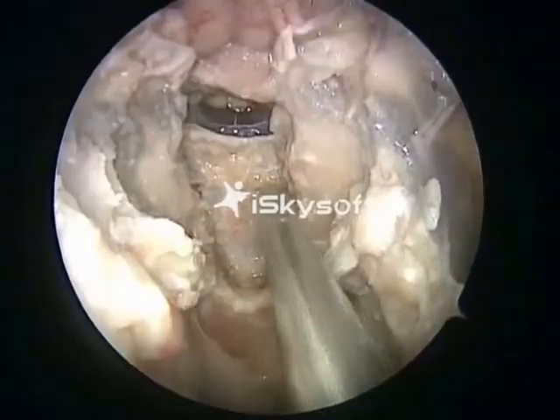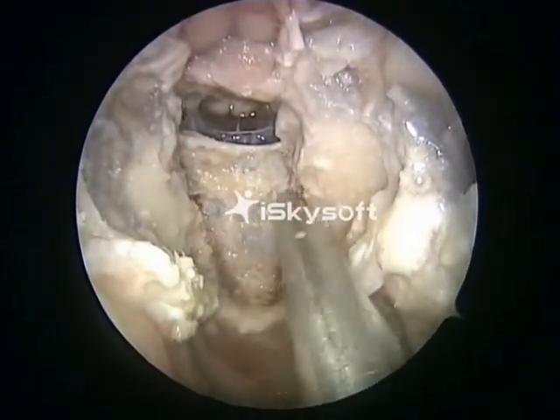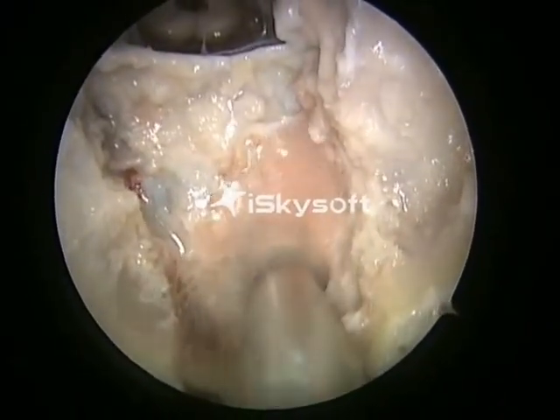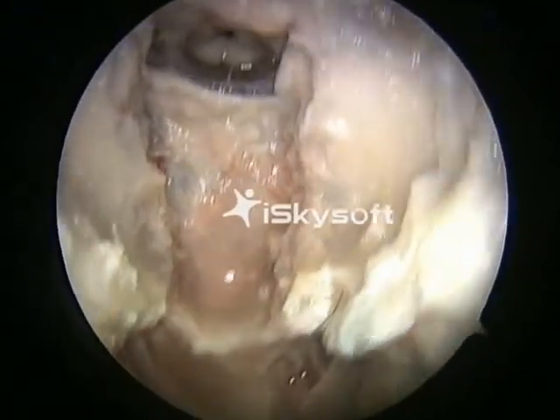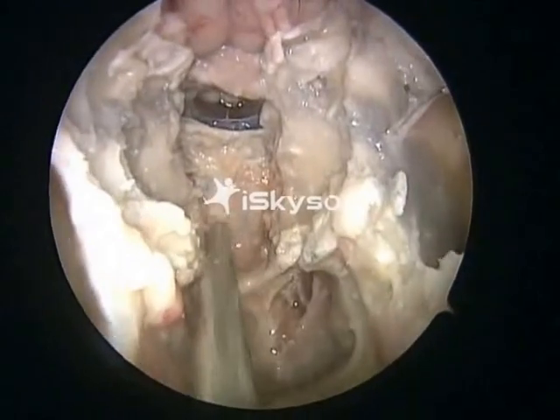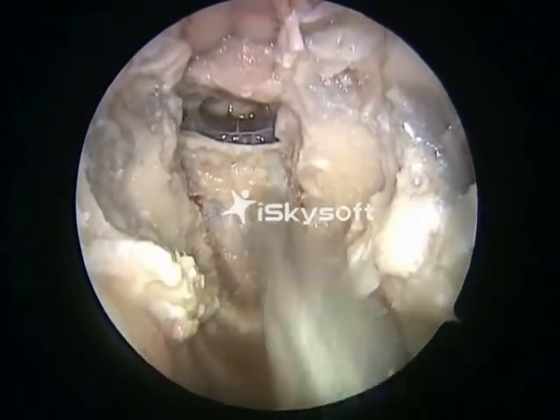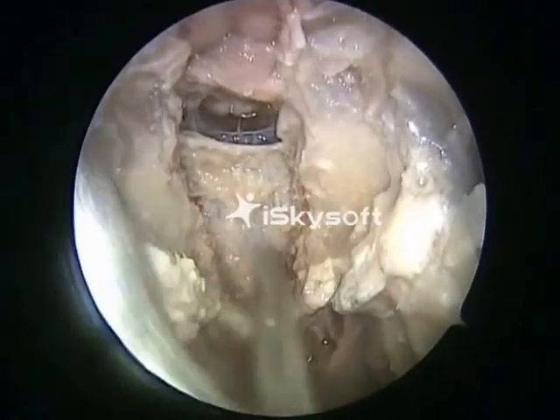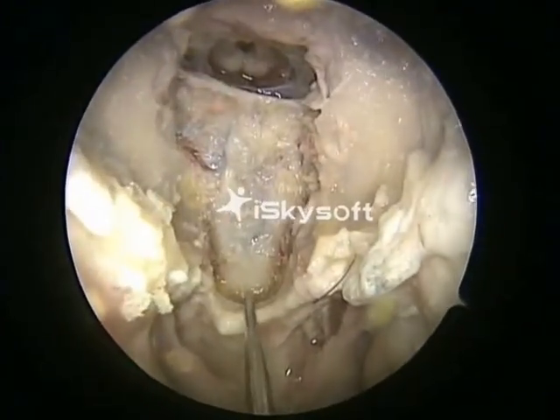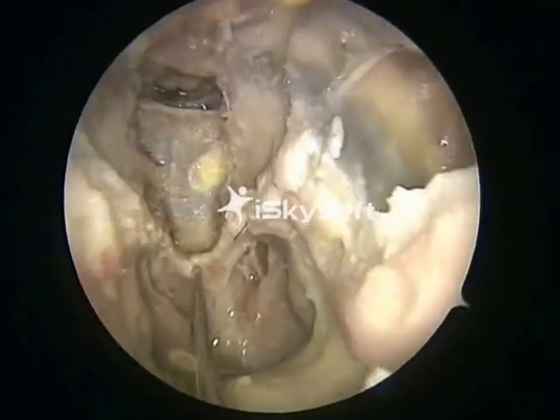You can see the dura very clearly. This is a fantastic exposure for tumors involving the clivus, like clival chordomas. That's a navigation probe being used now to determine the lower limit of dissection.